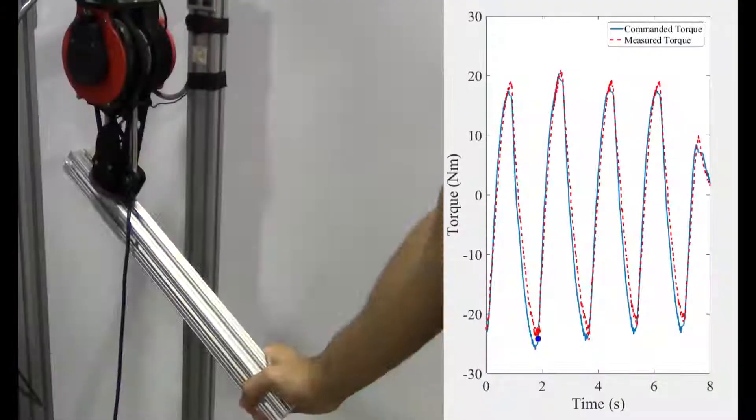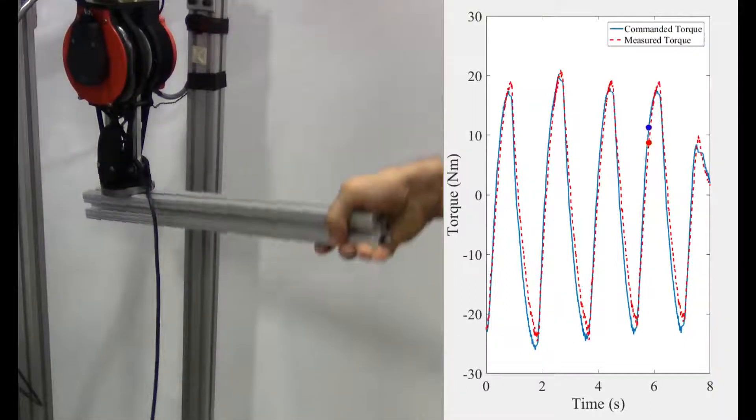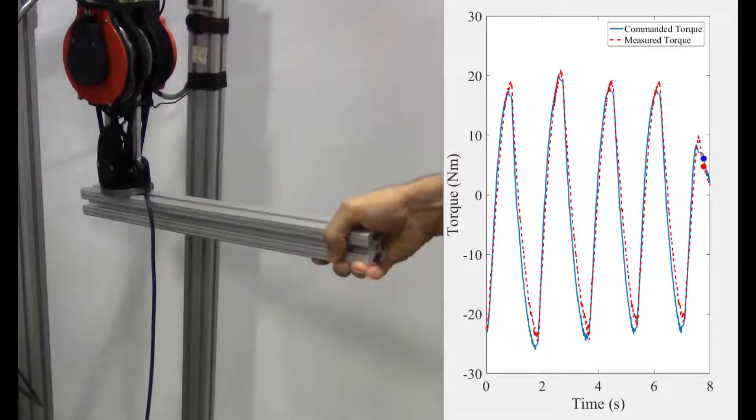Lastly, we see that the intrinsic impedance and unmodeled dynamics of the actuator are sufficiently small to control joint impedance without torque sensor feedback.